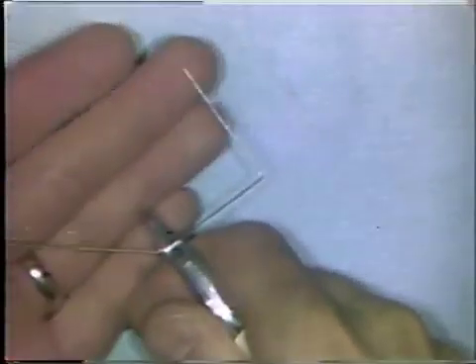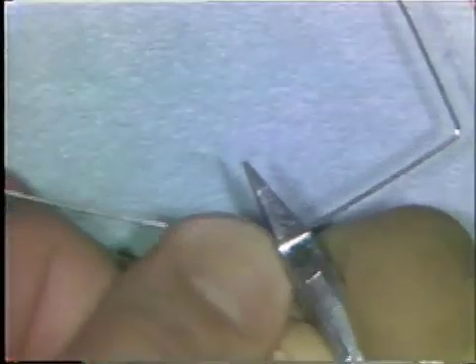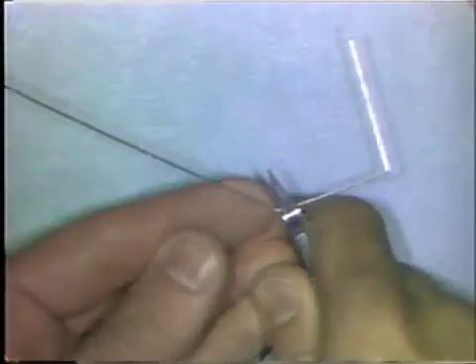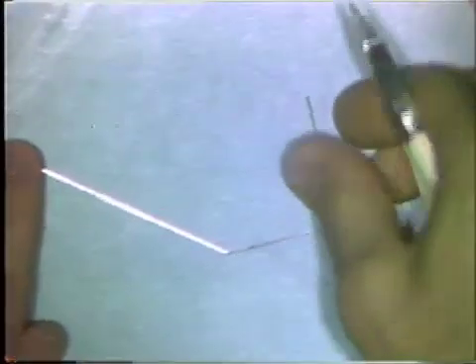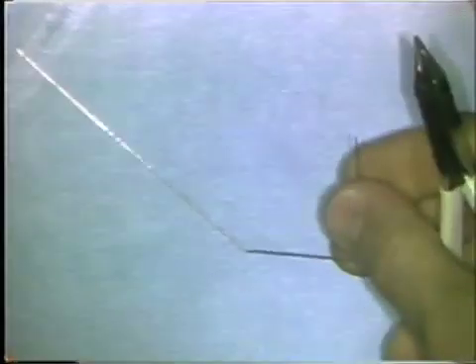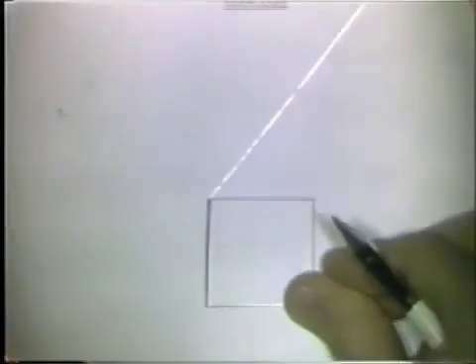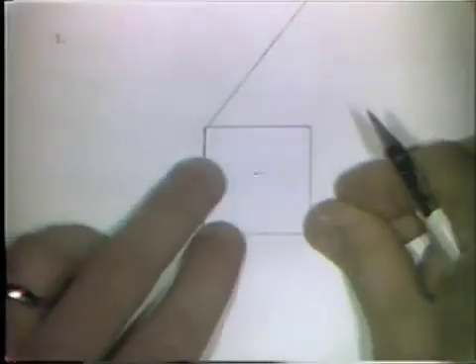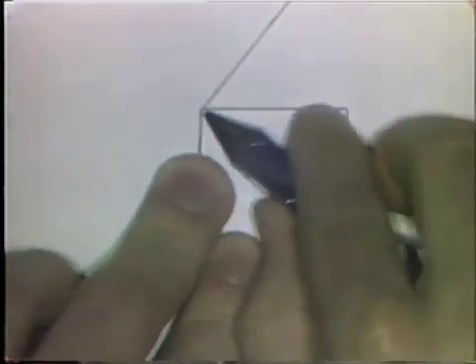In this manner, you place the flat base portion of the plier on the wire and use your thumb or finger and make a slight downward bend to adjust the flatness. And it takes a series of bends up and down to achieve the ideal flatness that you want. After you have it flat, you place it again on the pattern and determine if you have located the bend in the right spot according to the exercise pattern. You see if you've started the bend in the right spot.